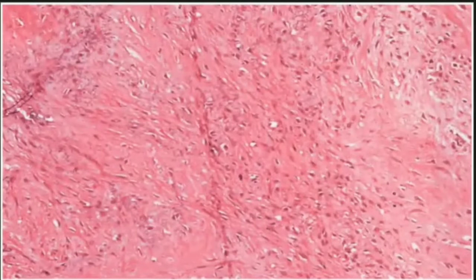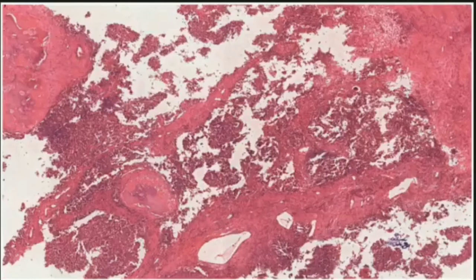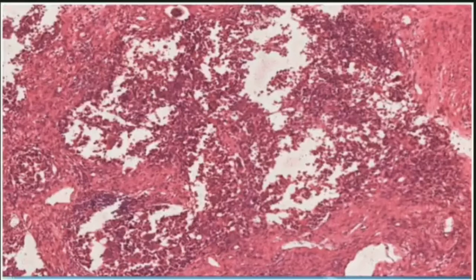And this is the spindle cells arranged in fascicles, and the spindle cells have a benign nucleus, and a few spindle cells showed eosinophilic cytoplasm. And this tissue shows numerous blood vessels arranged in a staghorn pattern. This is the low power of the bone marrow elements around the fibrous tissue, and a few areas showing focal areas of bony trabeculae. This is the highest power. Bone marrow elements are there.